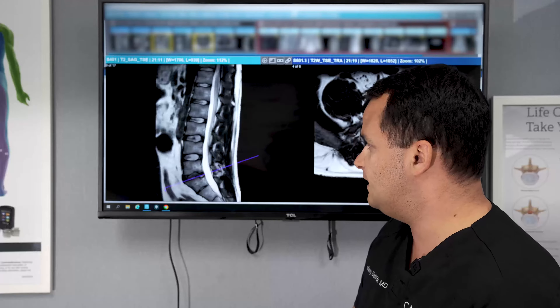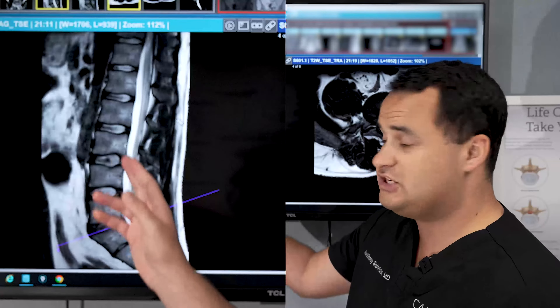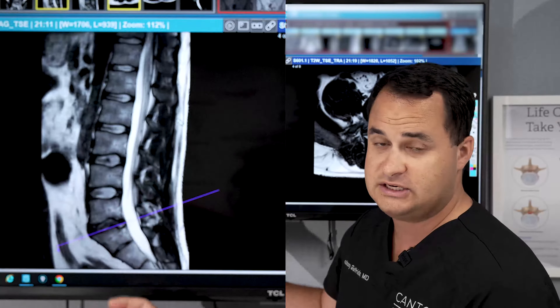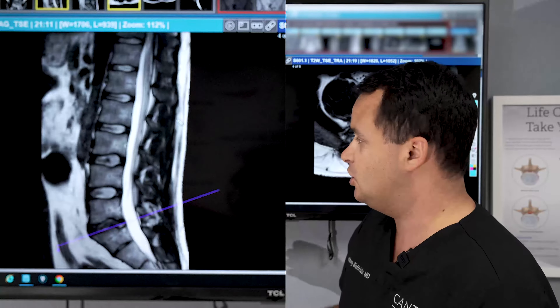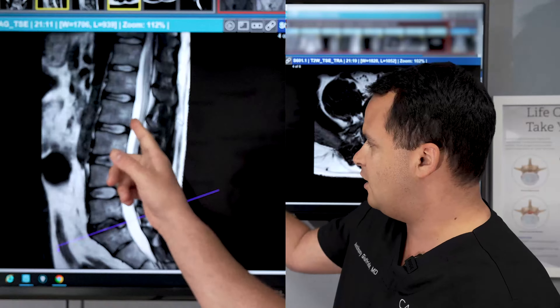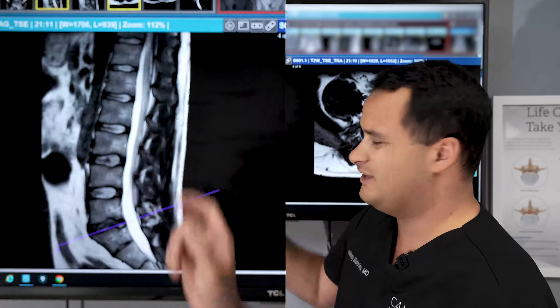We'll start with the basics. This is a T2 weighted image. Why is that? Well, the CSF is bright — that's how we know it's a T2 weighted image versus a T1 weighted image.